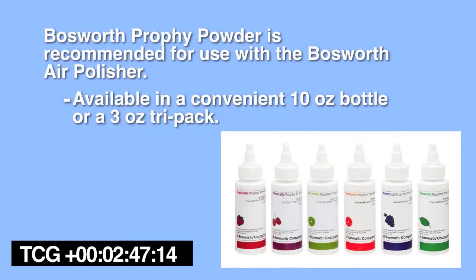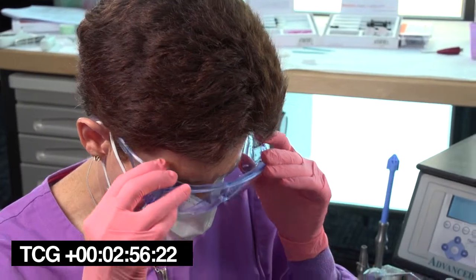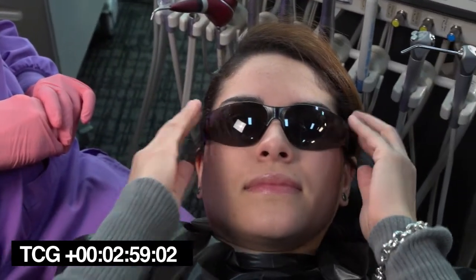Bosworth Profi powder is recommended for use with the air polisher. Available in a convenient 10-ounce bottle or 3-ounce tri-pack. The air polisher operator and the patient should wear eye protection.